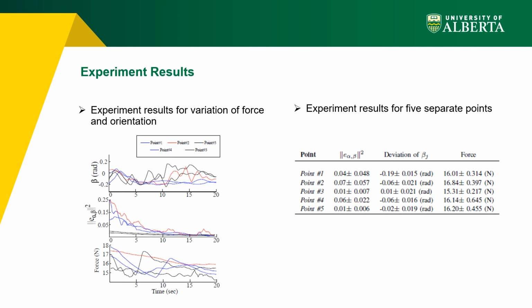In this study, an Axia 80 M20 force-torque sensor is mounted on a Panda robotic arm, and an adapter was built to hold the US probe. The US machine used for this experiment was an Ultrasonix Touch with a linear transducer. For this experiment, we only used the 2D functionality of the US probe. Images from the US machine were captured in real time with an EpiphanCapture device for processing. For our experiment, we used a tissue phantom made of plastisol. The controller was programmed and implemented in MATLAB. The communication between robot and computer was done over UDP.